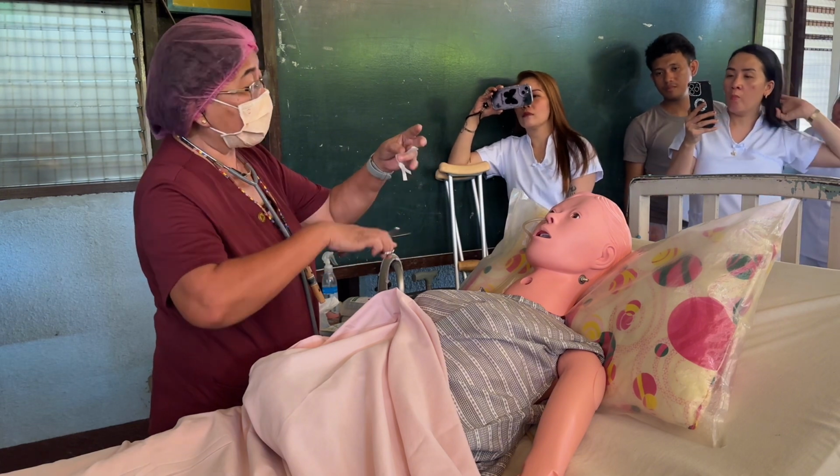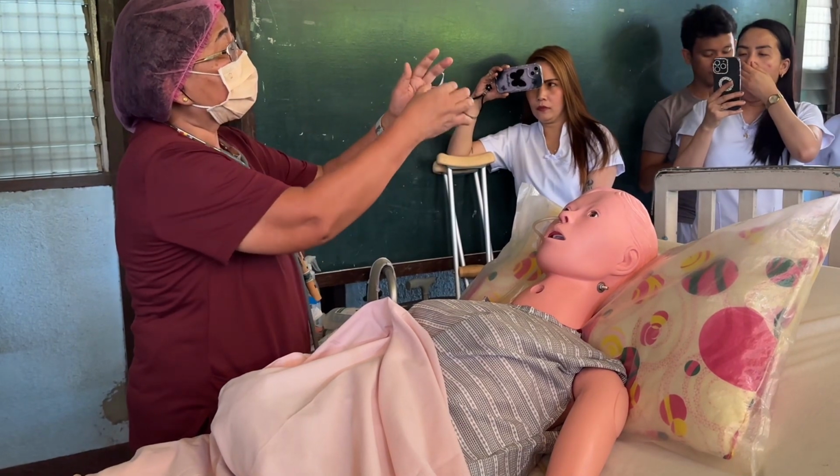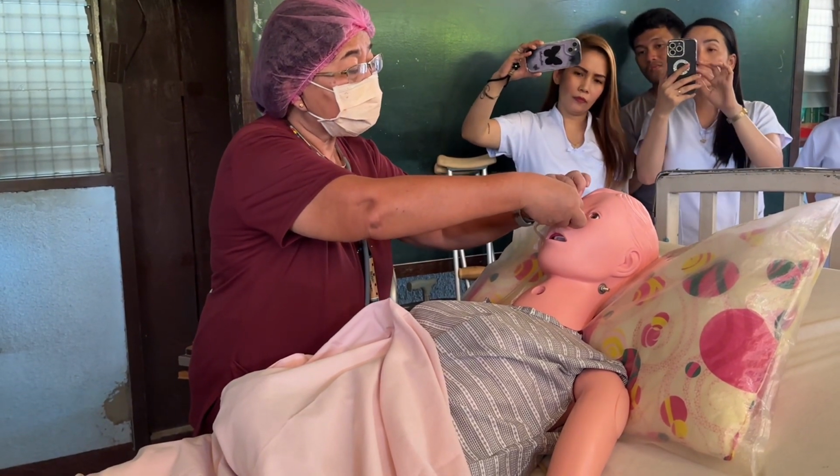So there should be a base left. What do I mean by base? It should not be totally split, but a base should remain at the tip. And then I'm going to put it at the bridge of the nose of the patient.